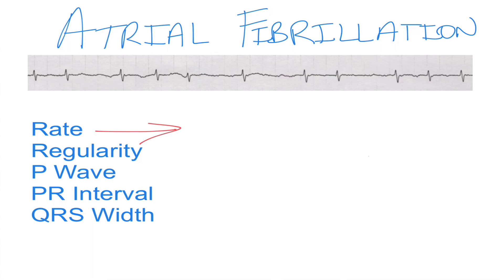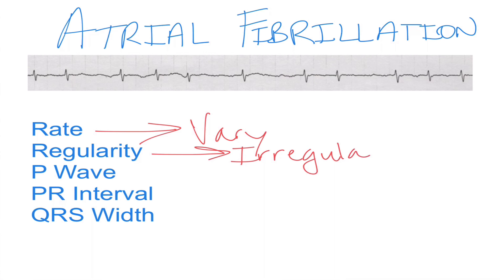You'll see on your monitors that the rate jumps from maybe 70 to around 130 beats per minute. It's very irregular, and that leads us into the regularity — it is a very irregular rhythm. You can see here in the strip that each of these QRS complexes are a varying distance apart from one another.